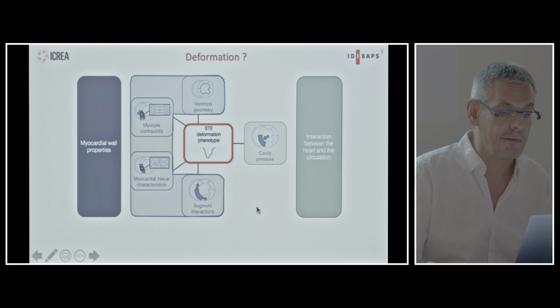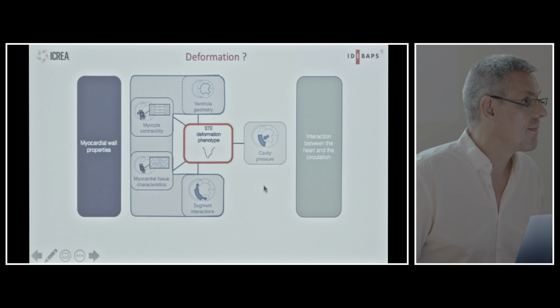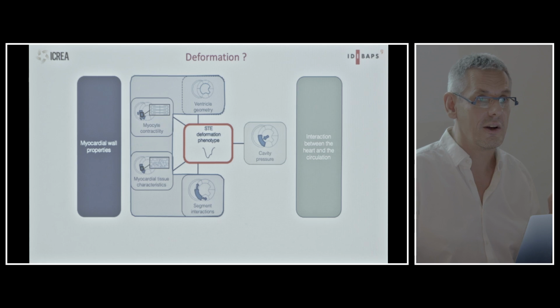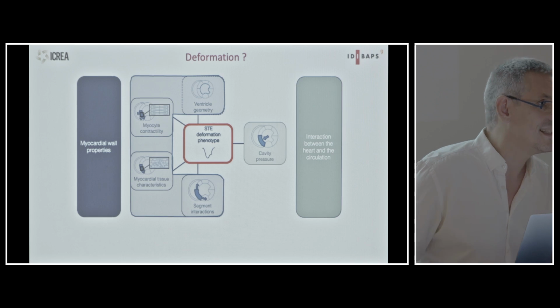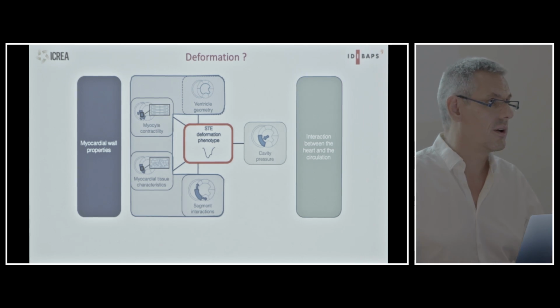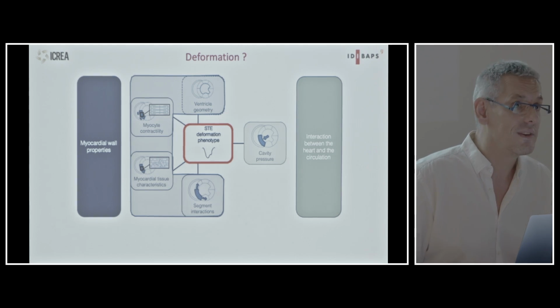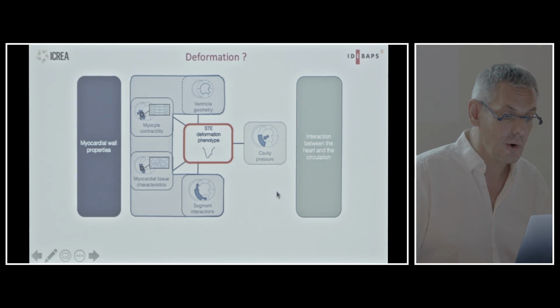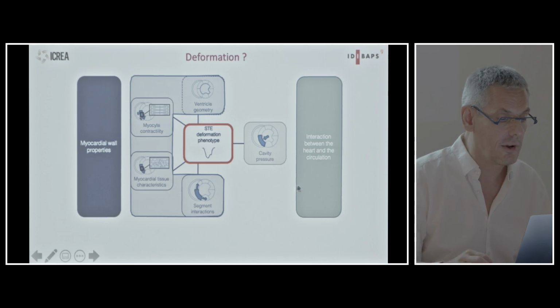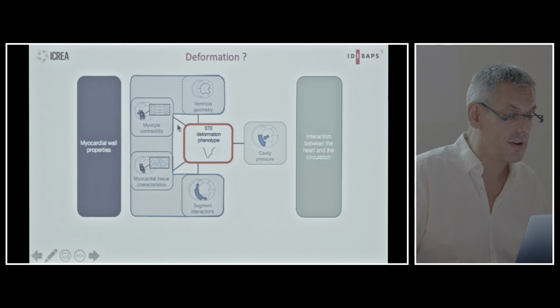And when we look at, for example, the deformation and we try to understand the deformation, as said before, deformation is load dependent. Now, anybody that tells you that they found a load-independent parameter in cardiology is talking nonsense. There doesn't exist any load-independent parameter in cardiology by definition. It might be more or less load-dependent, that I agree, but it's never load-independent. So you always have to keep that in mind. And especially deformation is load-dependent. We'll come back to that later on also when we talk about volume and pressure overload. So we need to take that into account. And then, of course, deformation also depends on the geometry.